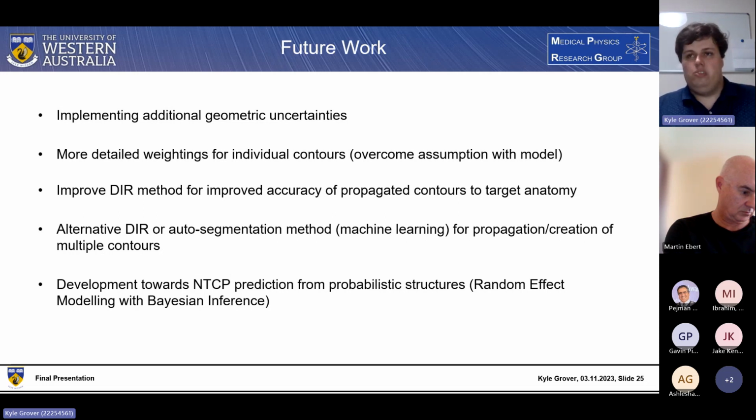Plus, they might be able to produce a bit better and higher fractions of high certainty regions compared to what was achievable with the deformable image registration process, where we had that very low region of agreement compared to the larger fraction of more low certainty regions.